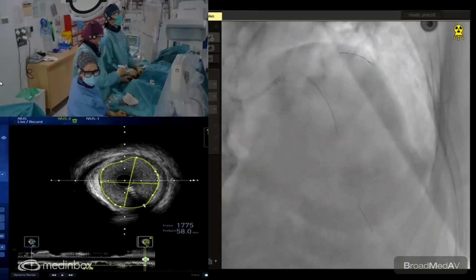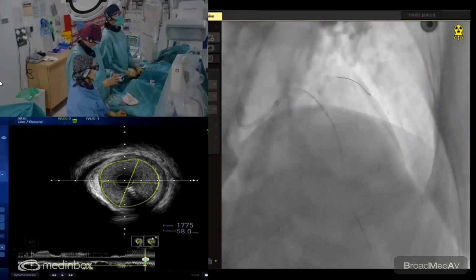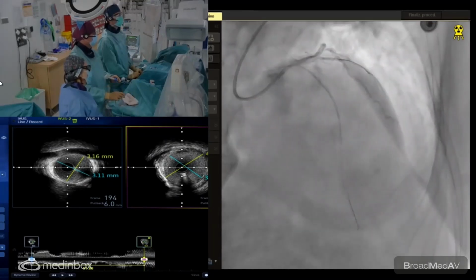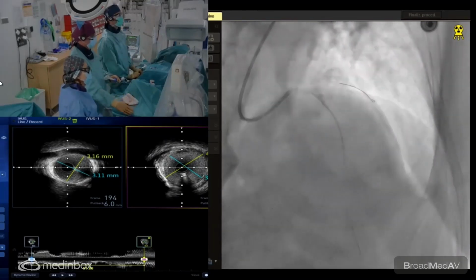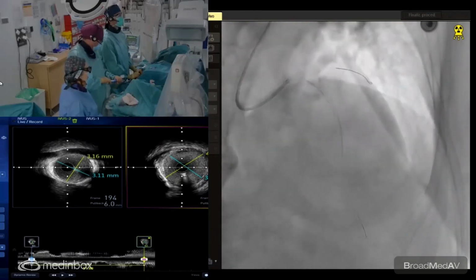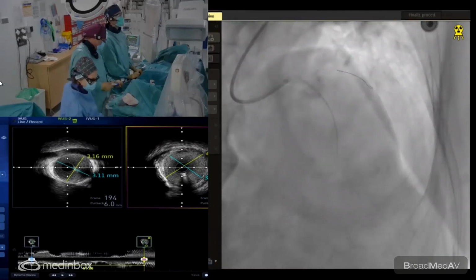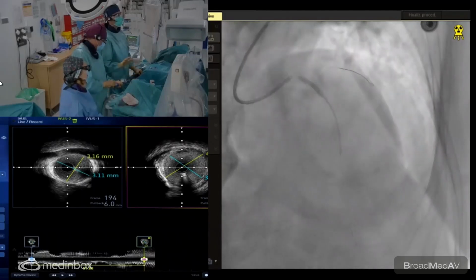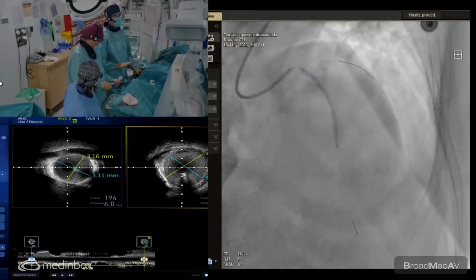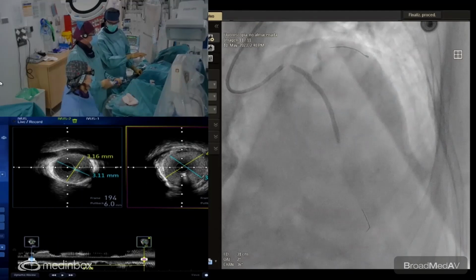As Guillermo advanced, the stent is advancing with some struggles, but quite well. And I think we are almost there. Okay. I think we are there. Let's go. We have the wire in the circle as a marker, and we are covering all the proximal part of the LAD just to nominal pressure. Only 10. I'm concerned that the distal part of the LAD may go down because the patient does not tolerate so well.